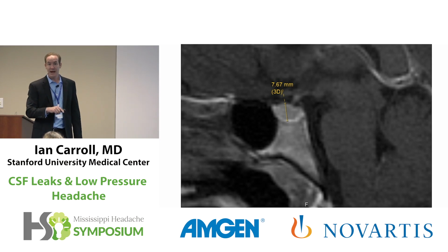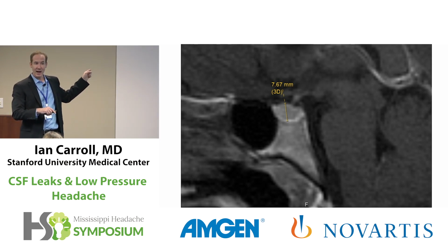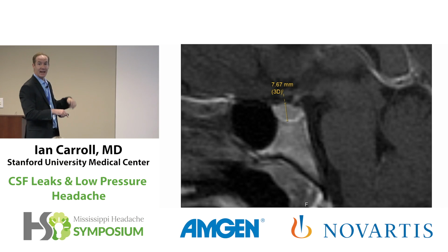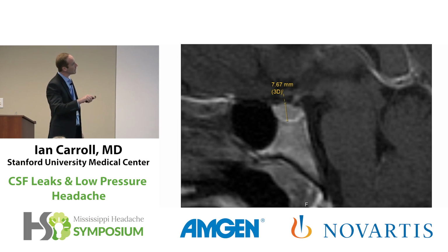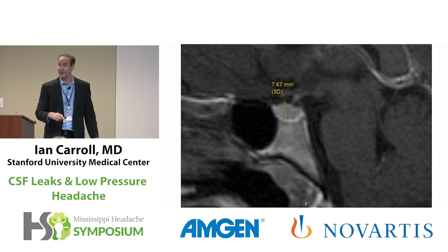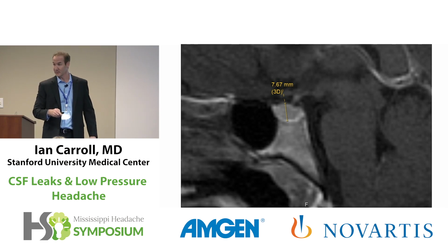All right? Now, to be fair to the people who read this MRI, they read this MRI a year or two before this paper came out, right? I'm not saying they did a bad job. I'm saying that how we do it today needs to be updated and needs to be better, because this was read as a normal MRI, and in the state of Mississippi, if you have a normal MRI, unless Christina Treppendahl is pushing you forward, you ain't going to get treated for your leak, right?